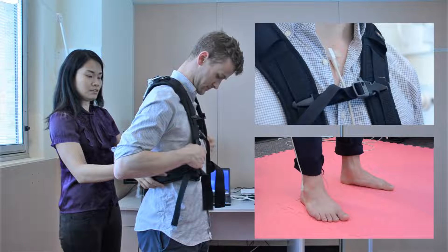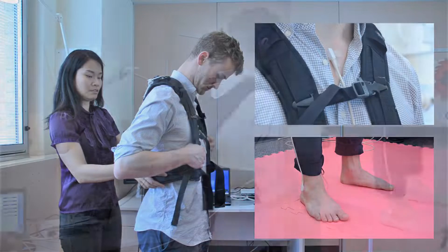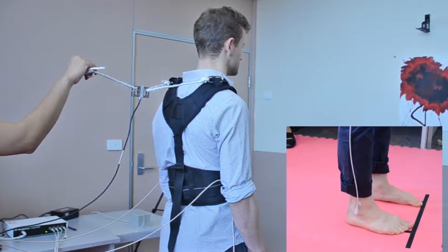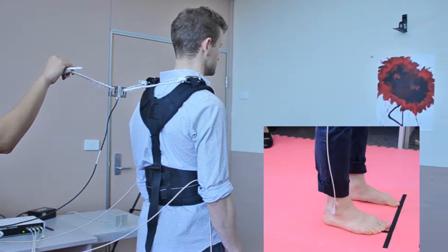First, apply the harness and attach sensors to the trunk and feet. The next step is to ensure the participant is standing in comfortable stance along line markings looking forwards.